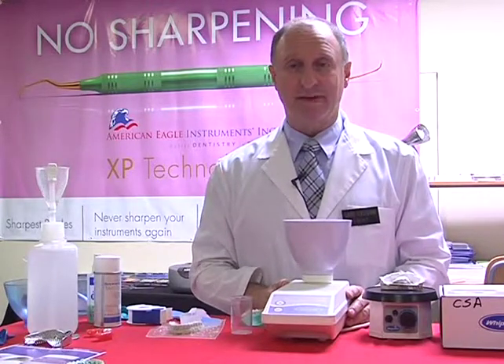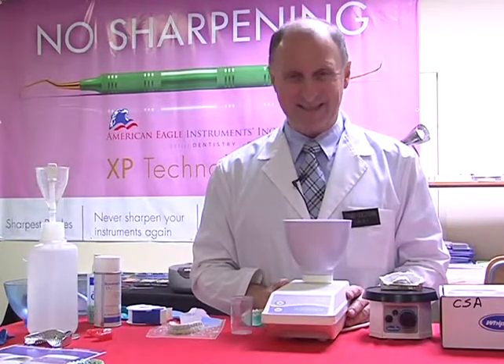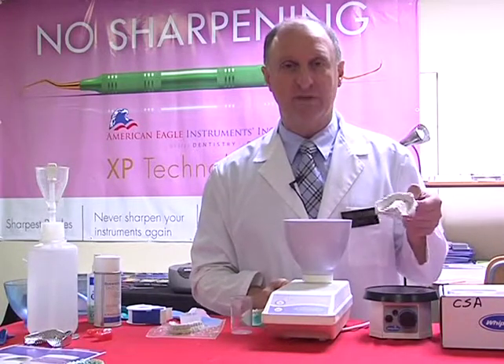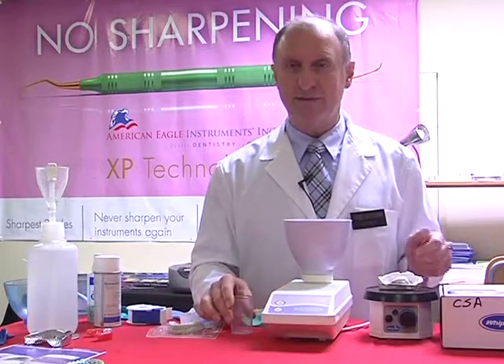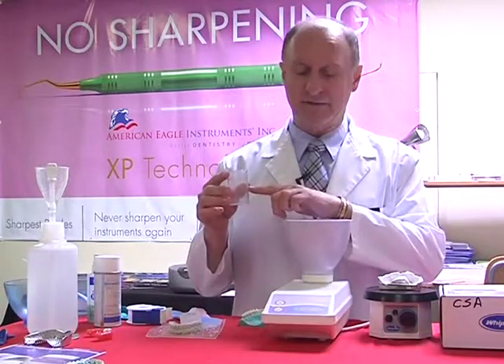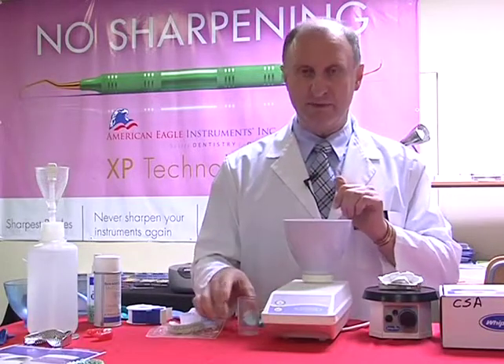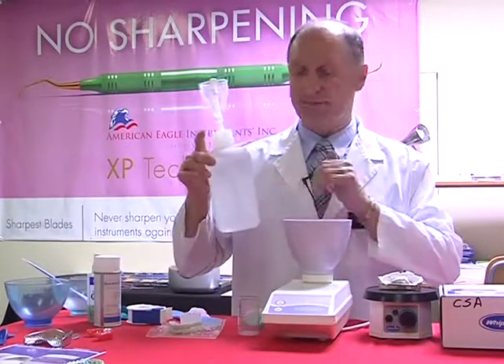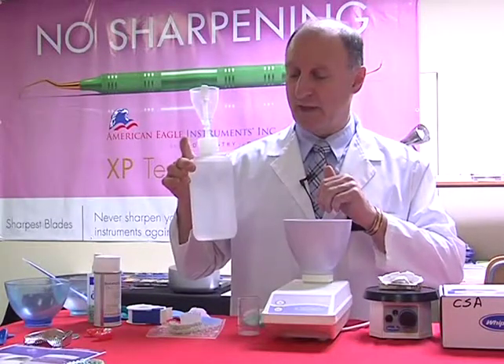Now, most of you out there probably eyeball it, so rather than guessing, we're going to measure our water. For every full impression that we're pouring, we're going to use the same amount of water that we would normally use for our alginates, in this case, the second level. Instead of using the water measure, which might interfere with the temperature, I'm going to use room temperature water that's kept inside the H2O dispenser.